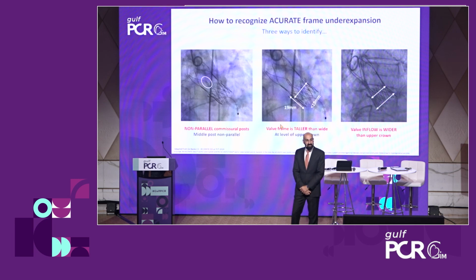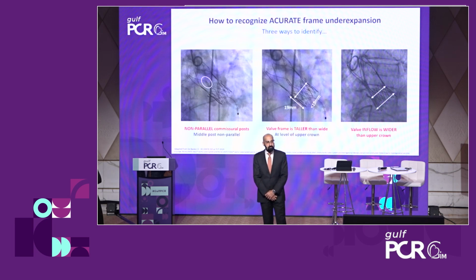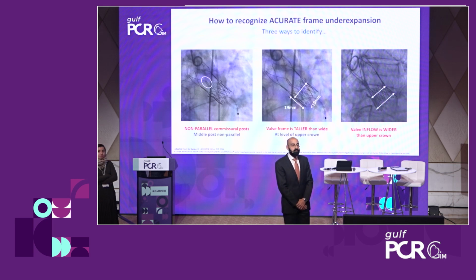My personal experience with the ACURATE has been really good. I think we now know under-expansion is a bad sign. We routinely or almost always pre-dilate or post-dilate stents in the coronaries, but we have hesitancy to do it in the aortic valve position, which I think probably might change in the future.